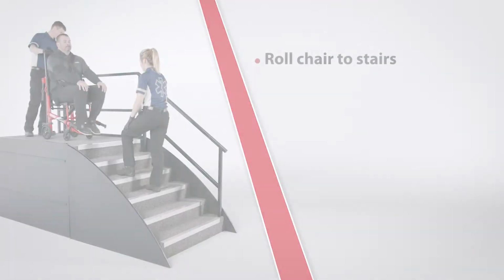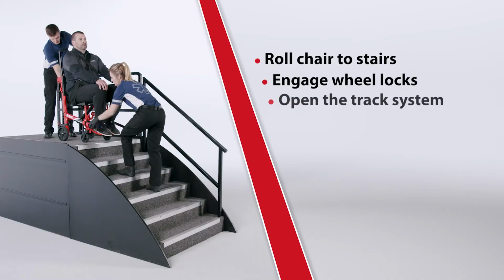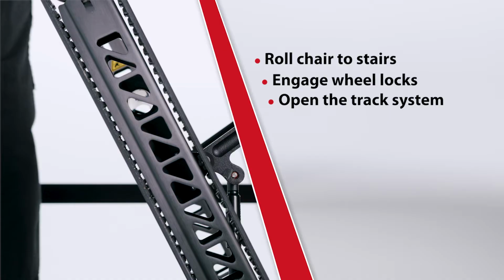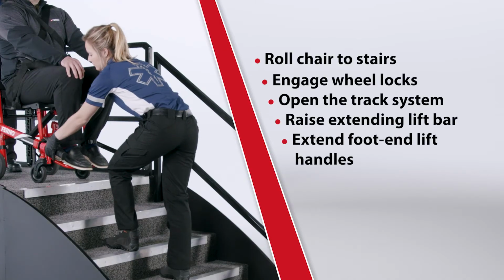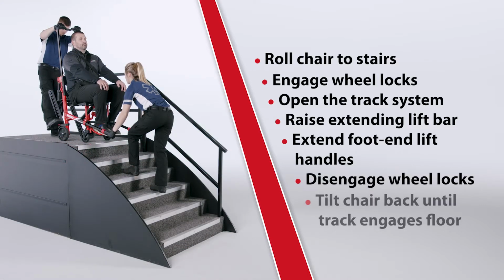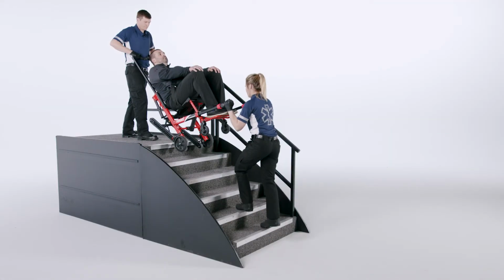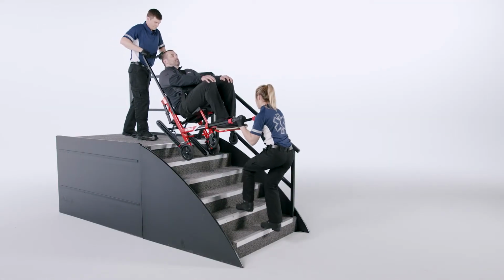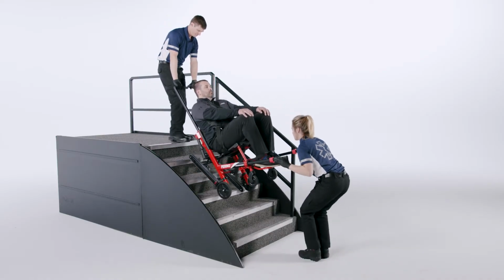Roll the chair to the stairs and engage the wheel locks. Open the track system and verify it is locked. Raise the extending lift bar if present. Extend the foot end lift handles. Disengage the wheel locks and tilt the chair back until the track belts engage the floor. Working together, guide the chair slowly forward and downward until the tracks engage 2 or 3 steps.